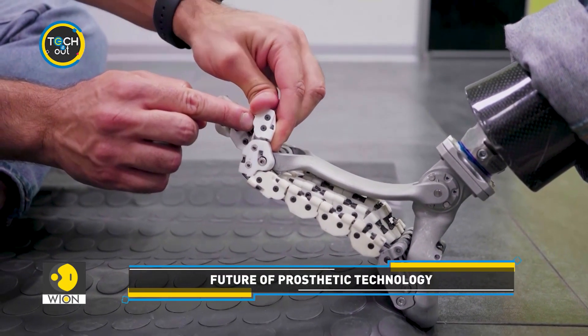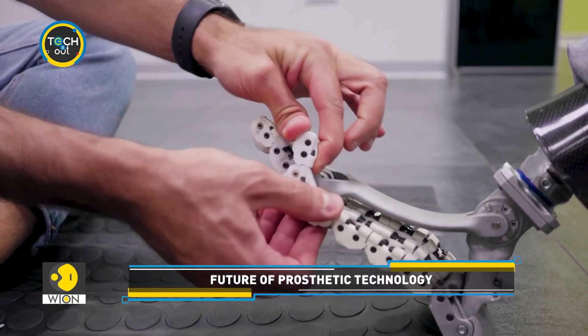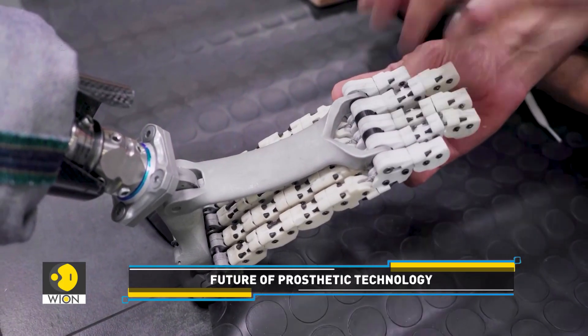Its innovative design has already secured two international patents, with a third currently under review by the European Patent Office.